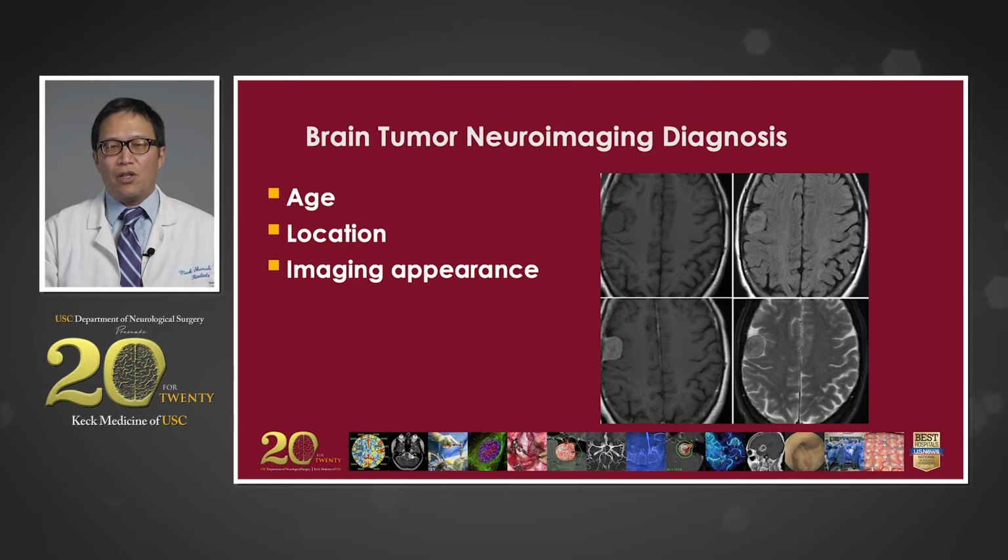Now, T2 weighted imaging is also very helpful because it gives an idea of the composition of a lesion. You can see also that the imaging characteristics of a T2 weighted image are quite different from that of a T1 weighted image, in that the white matter is relatively darker than the cortical gray matter, and it's actually the opposite of T1 weighted imaging. In the upper right corner, we see a T2 weighted FLAIR image.